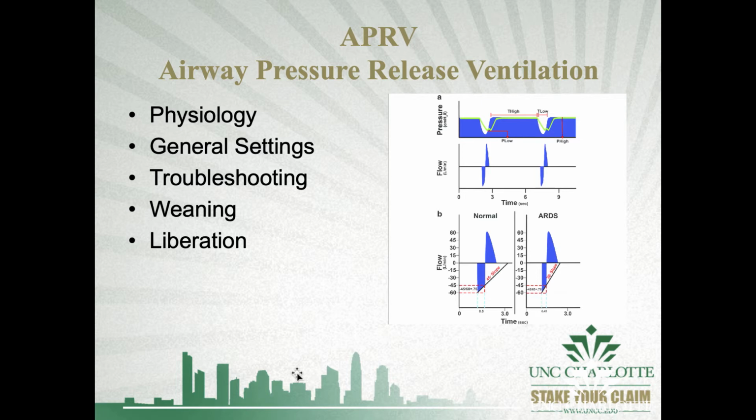In my opinion, you cannot get an accurate plateau pressure on a spontaneously breathing patient. If you have a spontaneously breathing patient on volume control, I don't think that's very nice as well, because you are limiting their flow. Remember, that is a constant. But we're going to transfer that over for our P-high.